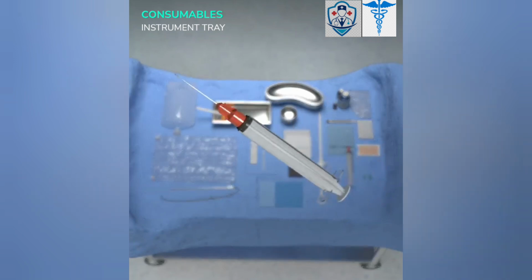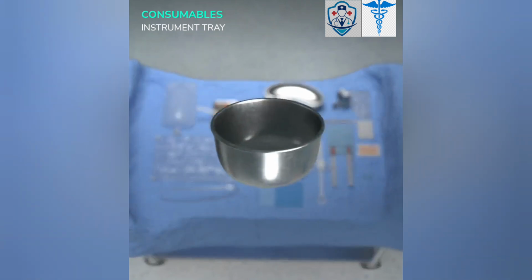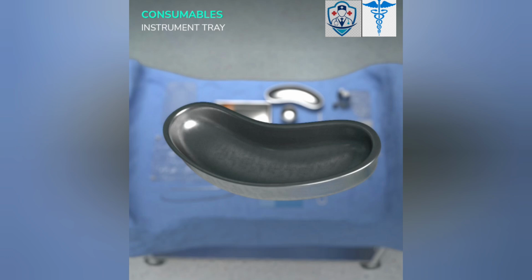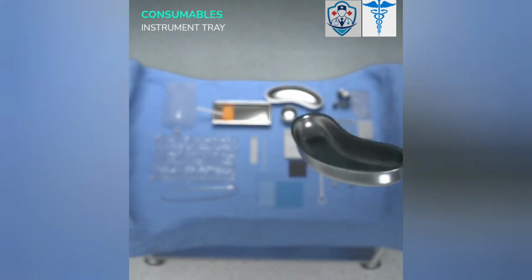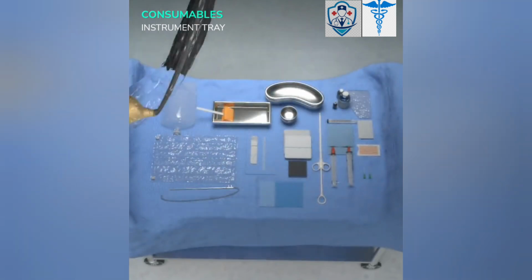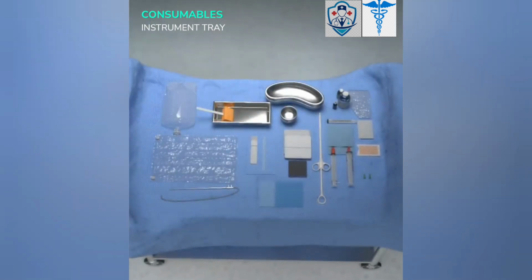The filter needles are used with the syringes to aspirate solutions. Gallipots are used as containers for liquids, as well as specimens and waste. Kidney dishes are used for the safe collection of medical waste. The laparoscope warmer is a sterile, single-use wrap that applies instant heat to warm scopes, preventing fog and condensation on the distal lens. The sterile camera cover should be placed around the camera attachment to maintain sterility.